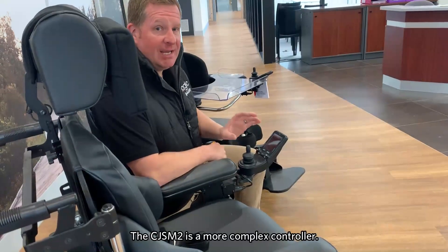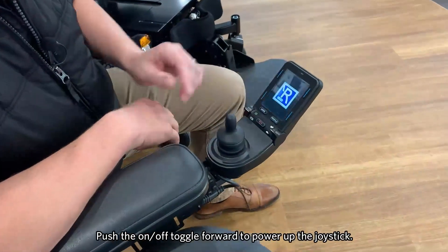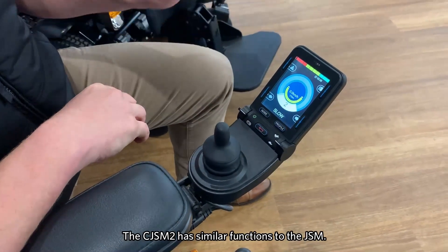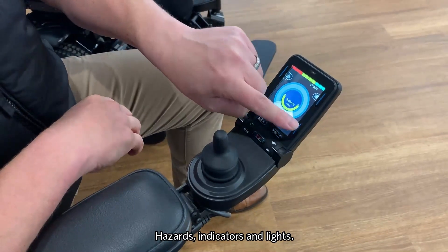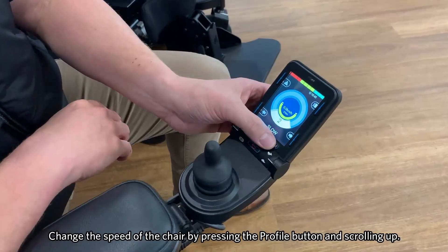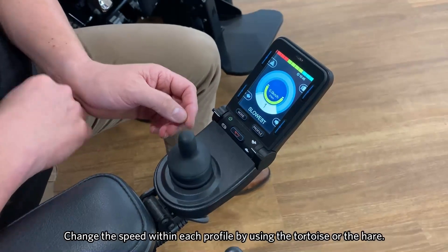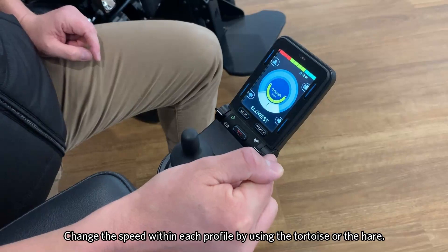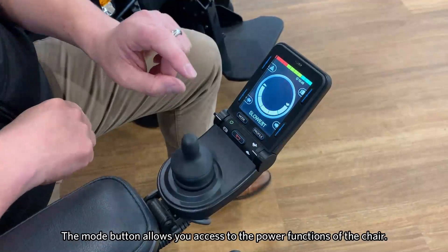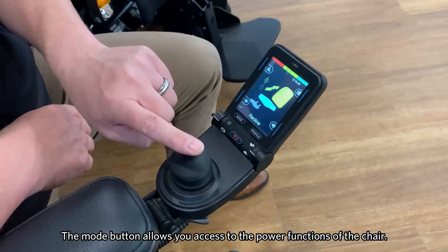Now we'll talk about the CJSM2, which is our more complex control system. Here we have the on-off toggle — by pushing this forward, it allows us to power up the joystick. Similar to the JSM, we have similar functions: hazards, indicators, and also the lights. Here we can change the speed of the chair by pressing the profile button — as you can see, scrolling up. We can also change the speed within each profile by using the tortoise or the hare. And then we also have the mode button, which again allows us to get into the power functions of the chair.